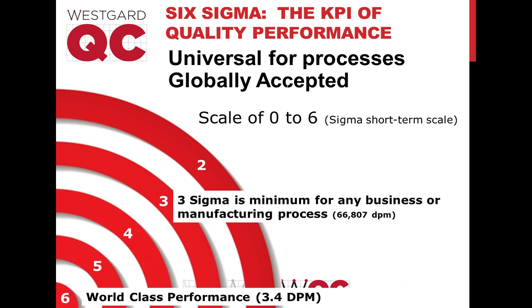Okay, let's go with this next question. What is the laboratory to do when they have tests, for example, total CO2, with terrible Sigma metric performance? There isn't an option to change chemistry instruments, so what is a lab to do?